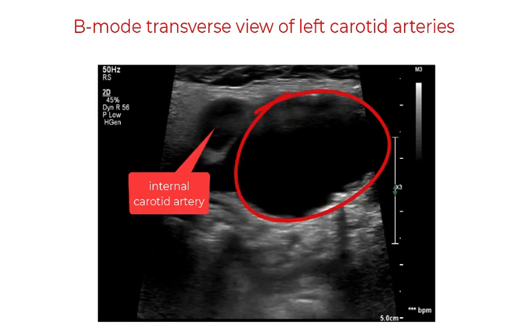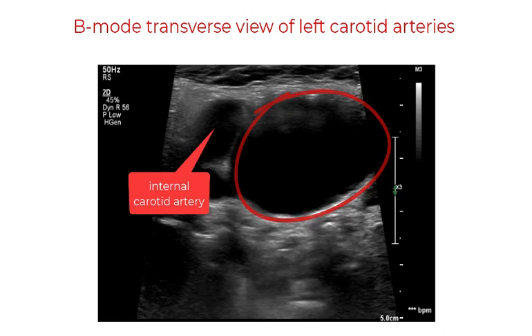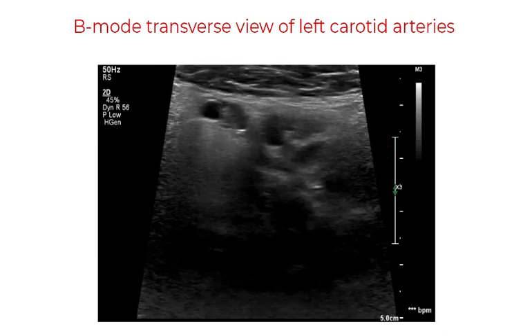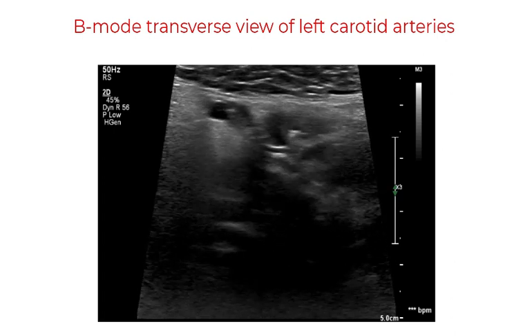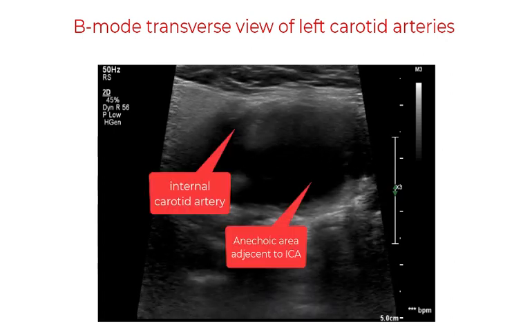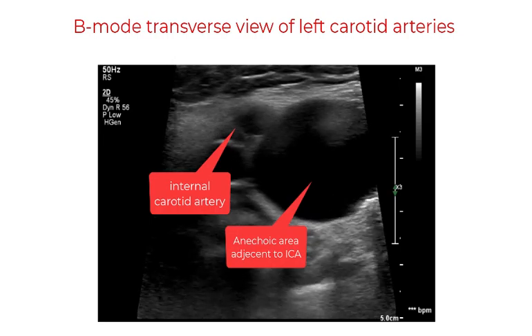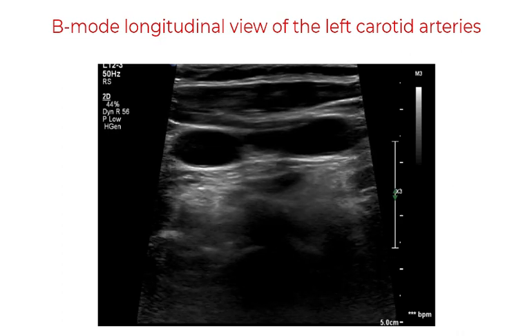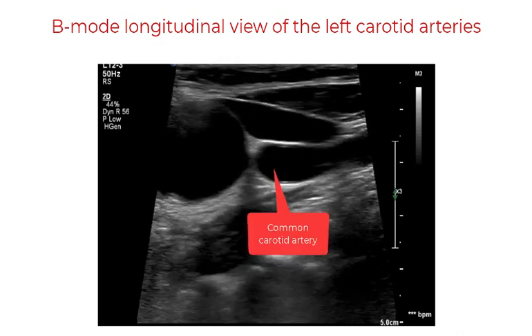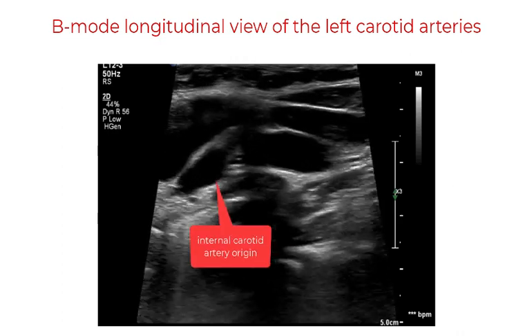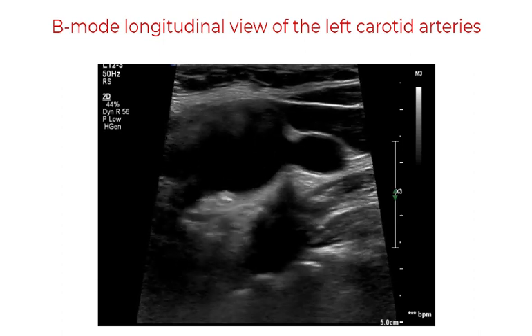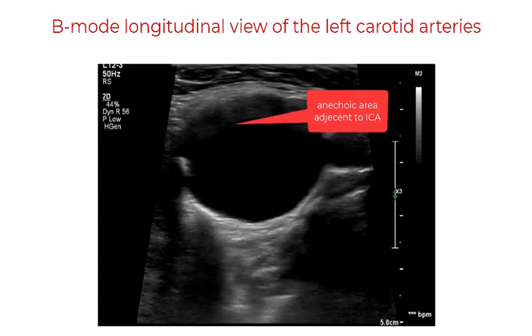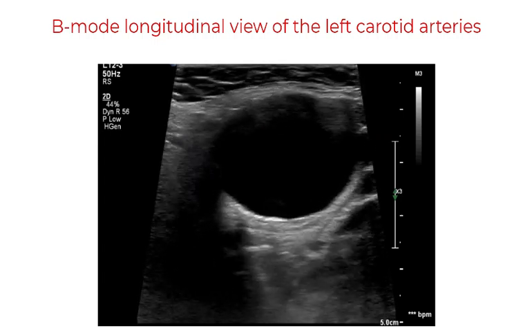We can note here the normal caliber of the internal carotid artery adjacent to this large anechoic region. By moving the transducer back down towards the bifurcation and towards the base of the neck, we can observe again this adjacent anechoic region to the internal carotid artery. The transducer is then moved in longitudinal view to obtain a different view of this anechoic region. We can note that the common carotid artery is normal and this anechoic region lies just where the carotid bifurcation would be expected.